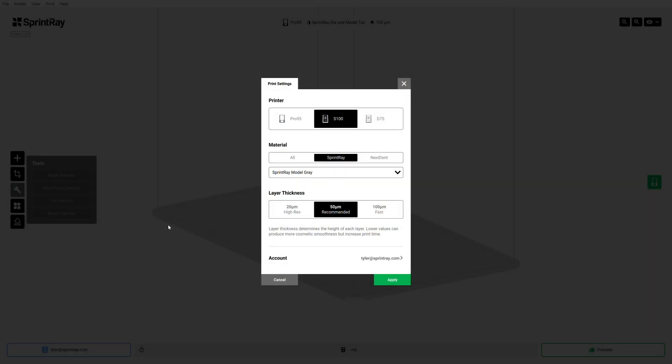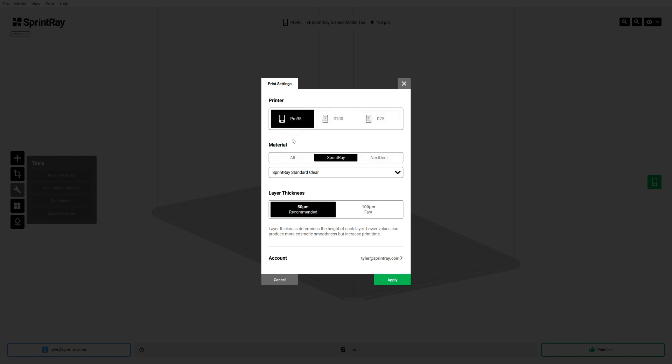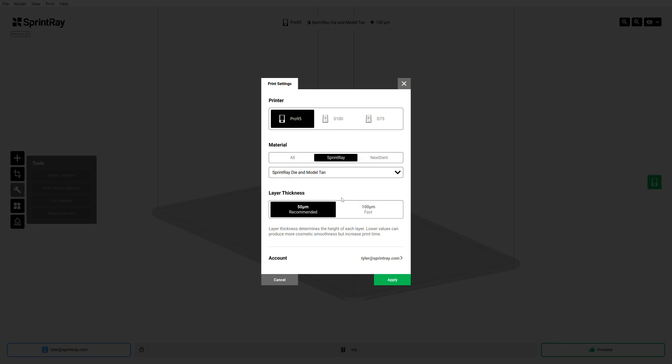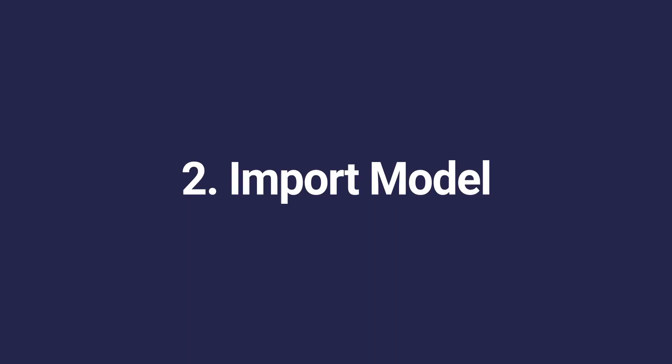So to begin, start Rayware and let's set it up to print. When we first fire up Rayware, we're going to be greeted with this screen. We're going to select Pro95 because we're going to be working with Sprint Ray Pro today, Sprint Ray resins, and then SprintRay Die and Model Tan is going to be the specific resin we're going to use. We're going to set the layer thickness to 100 microns. Once we've selected the printer, material, and layer thickness, we can press apply.